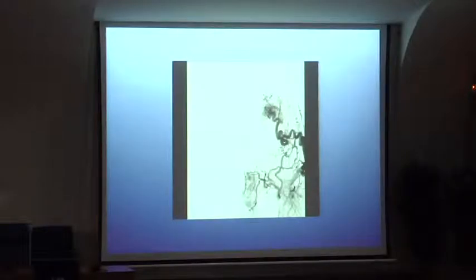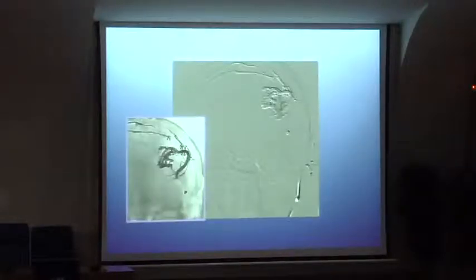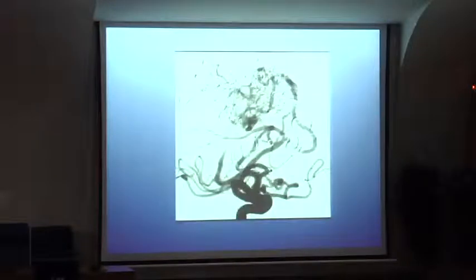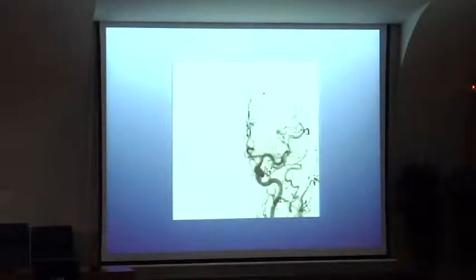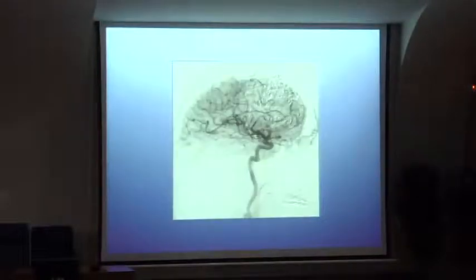And the second procedure, I use the temporal superficial artery. Next. AP view. Next. Next. And this is control, final control. Next. Only with embolization, without surgery, and final control, I treated the patient with temporal superficial artery. Next.